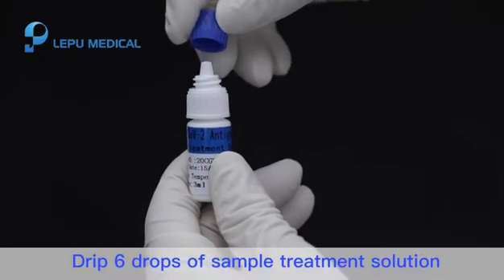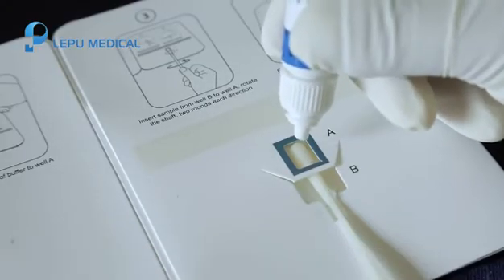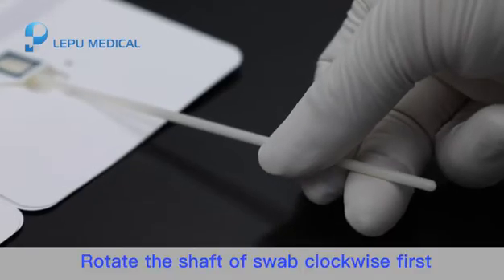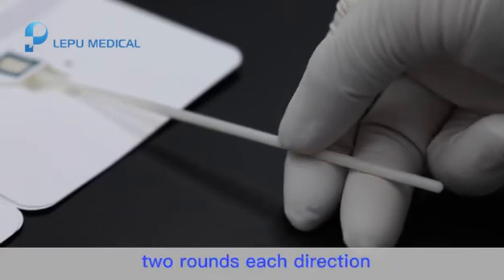Step 5. Drip 6 drops of sample treatment solution into well A. Please keep the test card flat during operation. Rotate the shaft of the swab clockwise first, then counter-clockwise, 2 rounds in each direction.